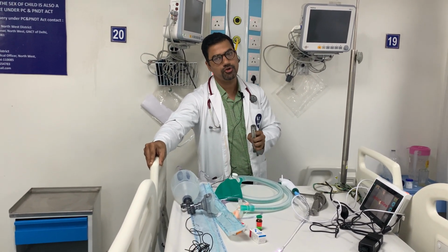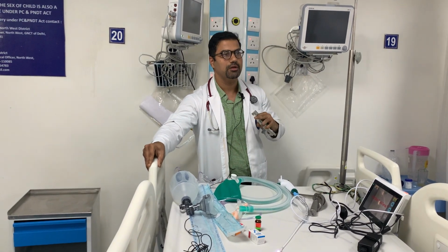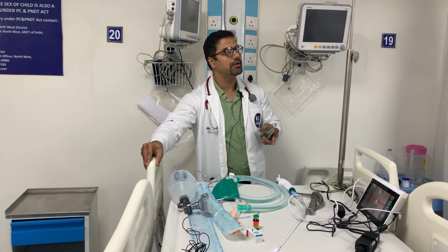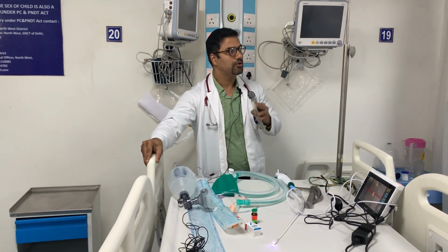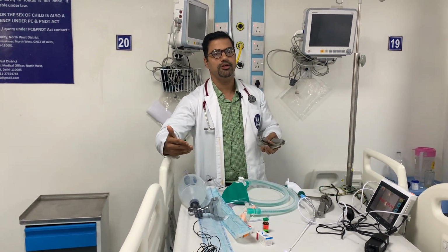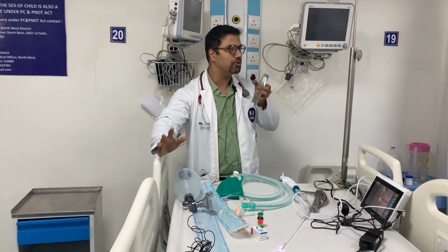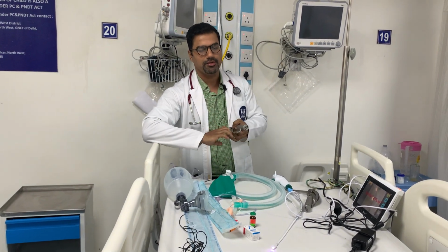If you are able to intubate the patient, it's good. If you are not able to intubate, whether any helping hand is nearby or not, whether you have got a backup or not, never ever hesitate in calling for help while intubating a patient. You should always be the first person to call for help. Whenever you are intubating a patient, a helping hand is always more than acceptable. So these are the basic requirements about drugs.